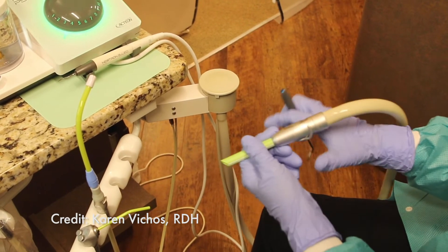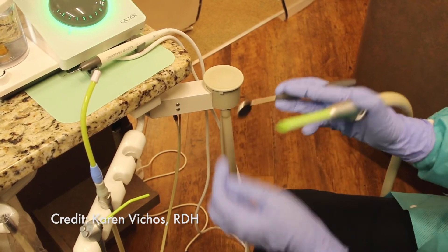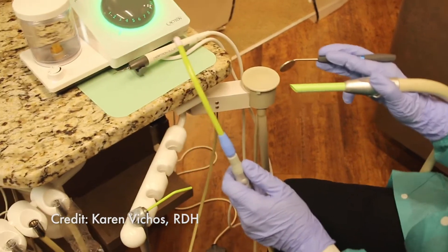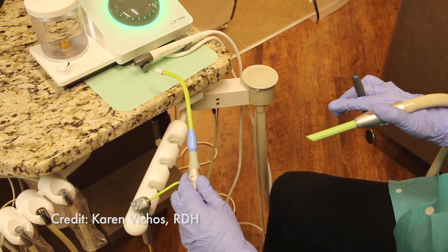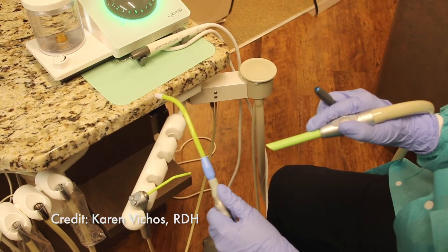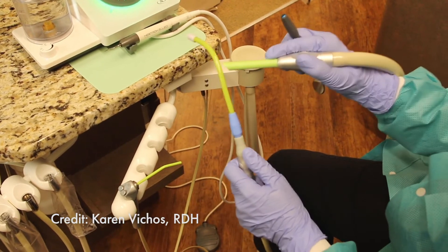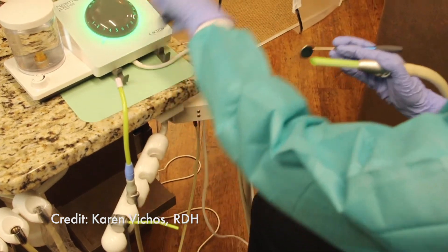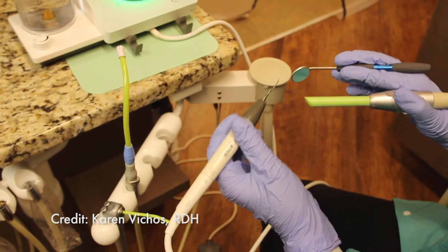After I place the HVE between my thumb and index finger and position my mirror between my index, middle, and ring finger, I take my low volume suction and put a little bend in it. As I turn it into the patient's mouth, there's an area where it can rest on the patient's lip, and then I place the tip towards the back of the mouth for collecting water and saliva. While this is in the mouth, I have free range of motion with my dominant hand holding my Neutron handpiece.